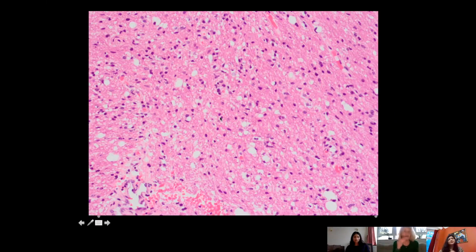Remember, the initial diagnosis here was maybe an abscess, maybe a metastasis. So this could have been the gliosis around something that was not sampled in the biopsy. But this doesn't really fit the criteria for reactive astrocytosis.